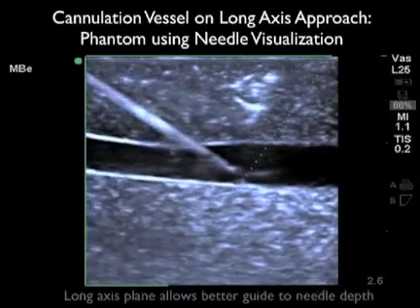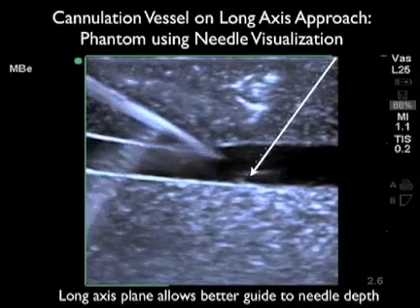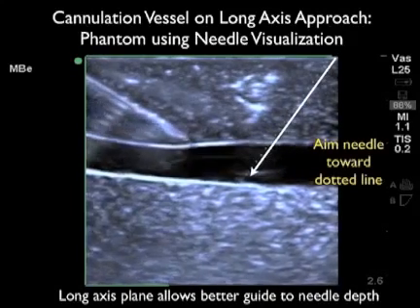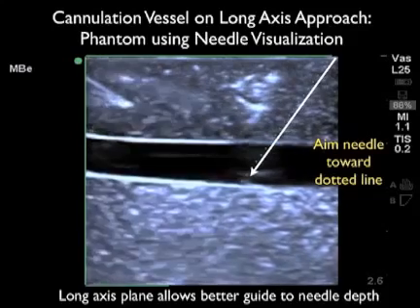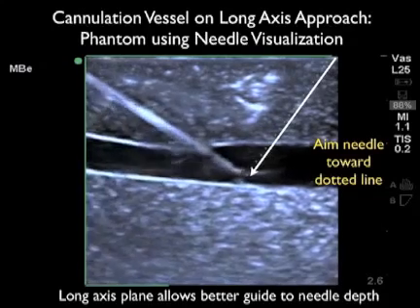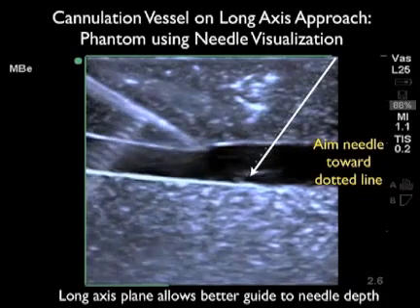What we see here is the tip of the needle is much more echogenic. We aim the needle towards the dotted line, which is coming from right to left on the image here. Now let's watch the needle coming in from left to right, and we can see that as the needle is in plane with the probe in the long axis approach, we can see the full extent of the needle as it travels from superficial down to permeate the anterior wall of the vessel and enter into the vessel lumen.